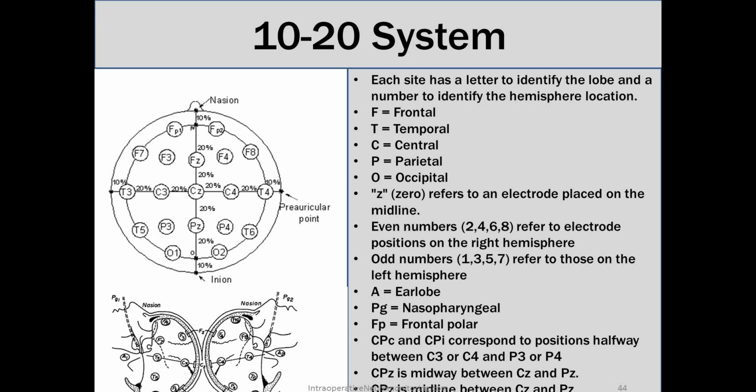CPZ is midway between CZ and PZ. So I think I skipped that other one real quick. CPC is an actual landmark as well, but it is also referred to as just a general way of describing things. So if you were talking about stimulating on the left on this study and everything is always coming from the left, it's easier just to say the contralateral or ipsilateral side.